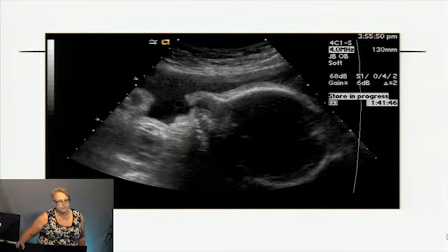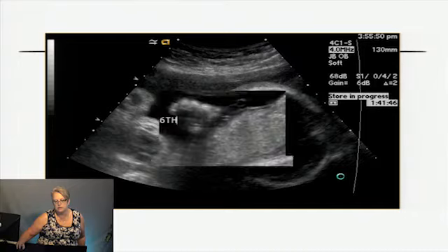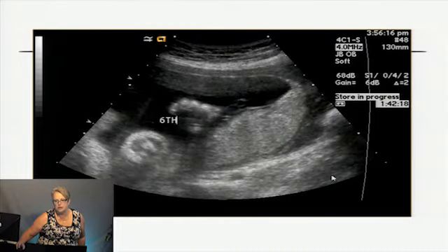This is my profile. So looking at top of the head, back of the head, a little bit of the chest, an arm here, and this is the chin tucked down to the chest. This is the area of the face, the upper jaw, and the nose. Let me look at everything else. I'm looking around. Now I'm seeing a thumb, 4 fingers, oh, and another one.